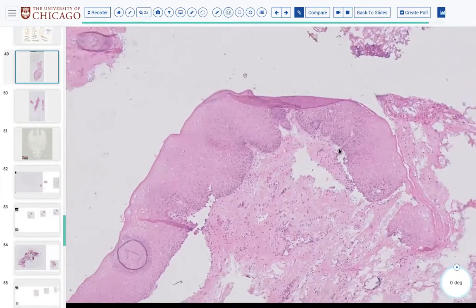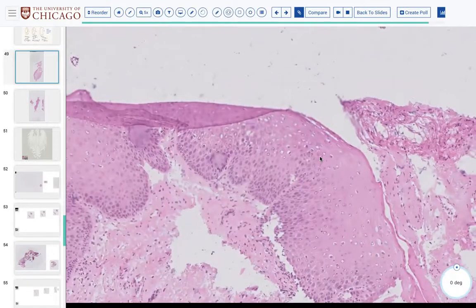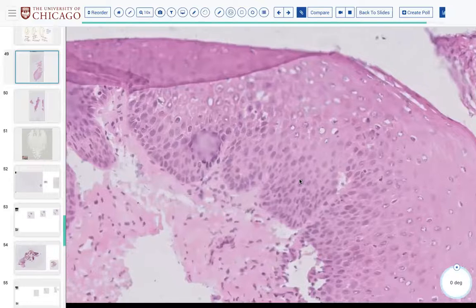Yeah. This kind of stuff depends on how broad of a brushstroke you want to provide. I completely agree with you that there's no in situ or invasive carcinoma here, so you're pretty much in the free and clear. Sometimes they will ask you if there's dysplasia. I've had this happen on occasion, and sometimes they will go after moderate to severe dysplasia. I would argue that there is dysplasia in this case.